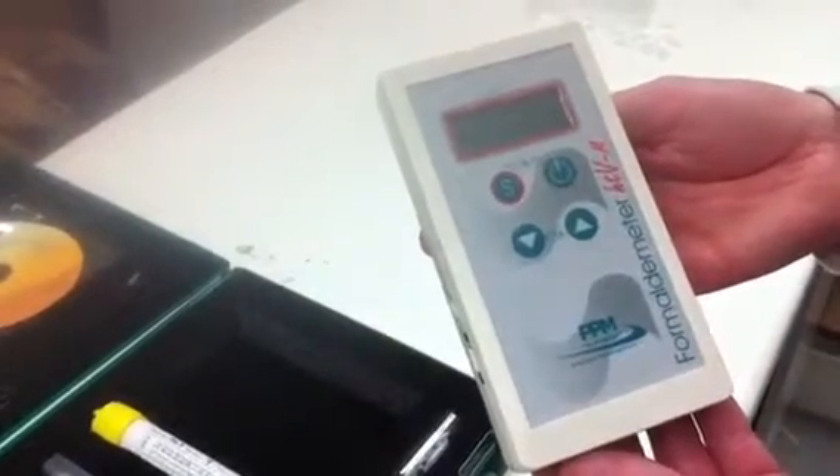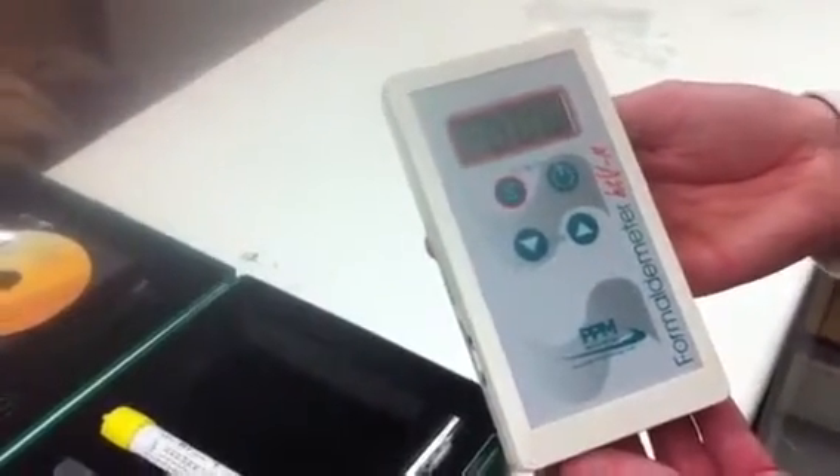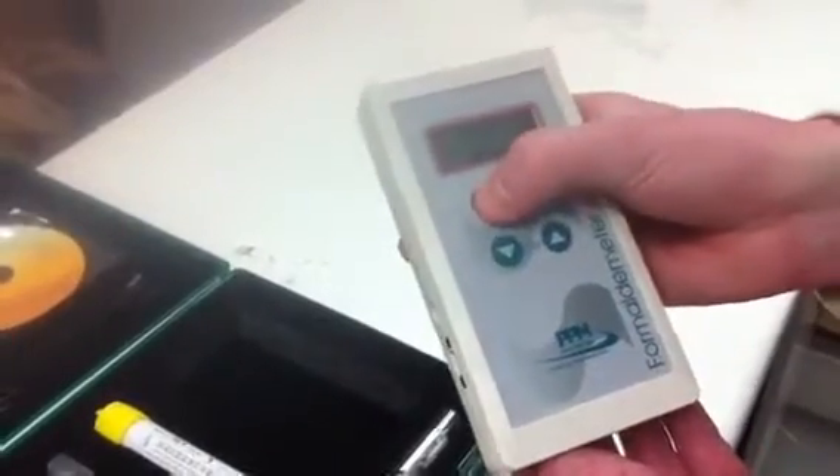Once you switch on, make sure that the zeros appear on display, and then you can take a sample by pressing the S button.